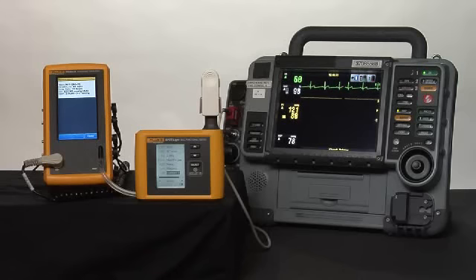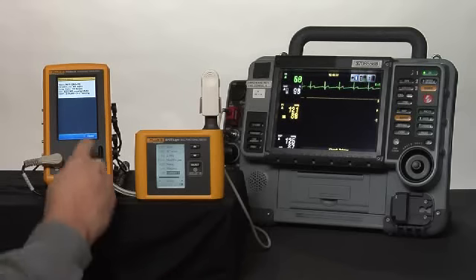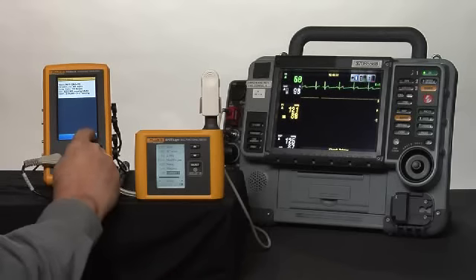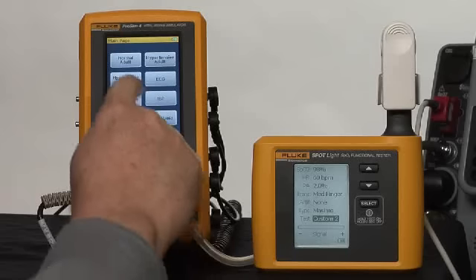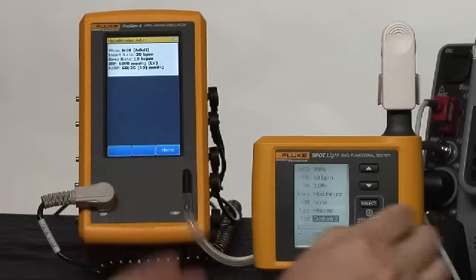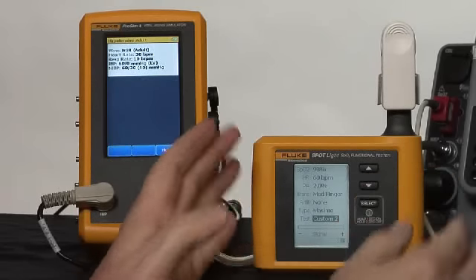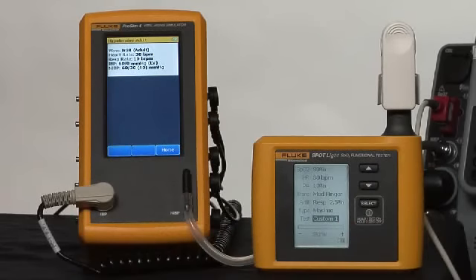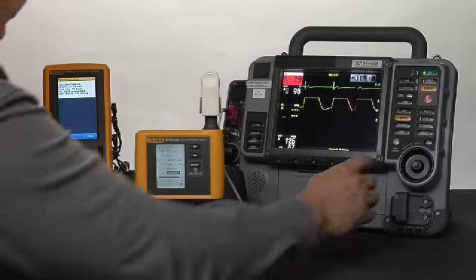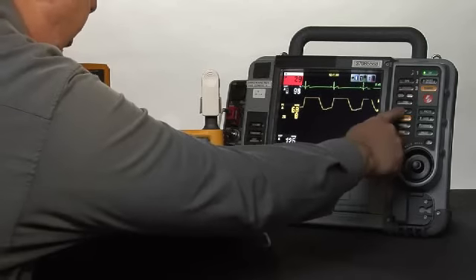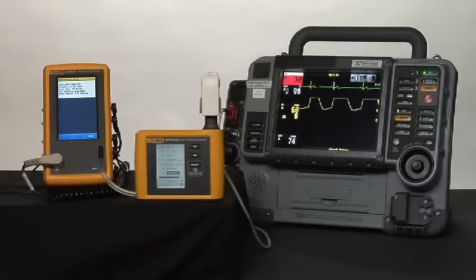Our oximeter value should be 98% and a heart rate from SPO2 of 60 beats a minute. We'll wait for our NIBP reading to complete. On the ProSim 4, we go back to the home screen, pick Hypotensive on Spotlight, we'll switch to Custom 1, and start another NIBP reading on the device.